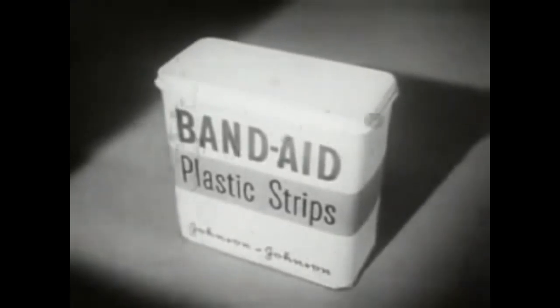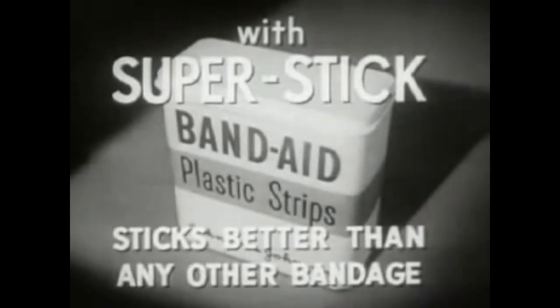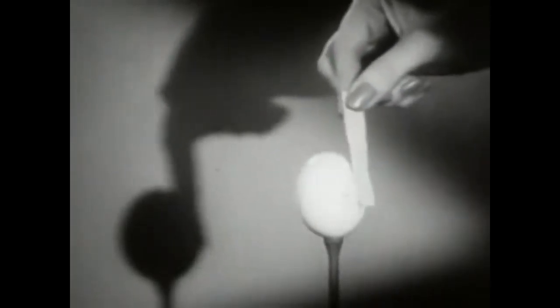Here is the new Band-Aid plastic strip with new super stick — it sticks better than any other bandage. The proof: take a dry egg at room temperature, touch the egg with any other bandage — brand X, brand Y, brand Z — not one sticks. But a Band-Aid plastic strip with new super stick sticks tight instantly.